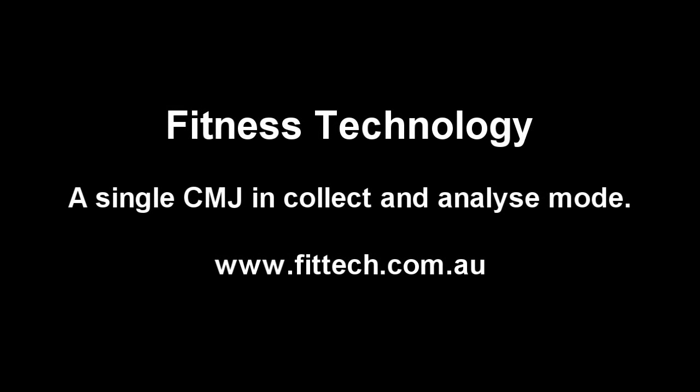The following video will show you how to conduct a CMJ in Collect and Analyse mode.